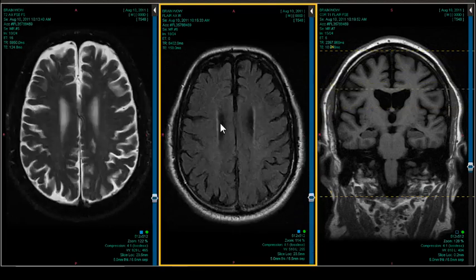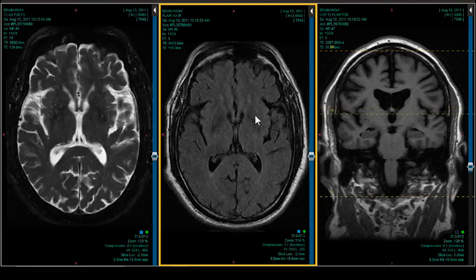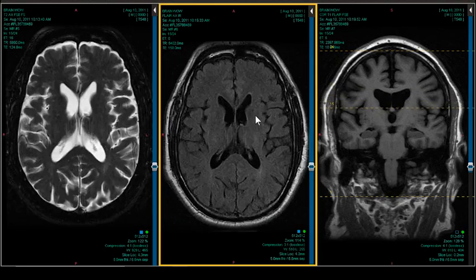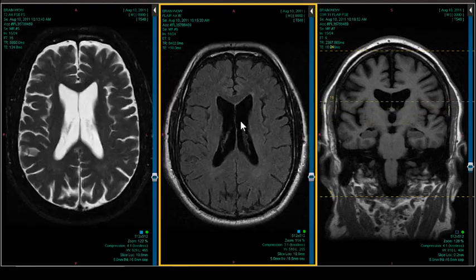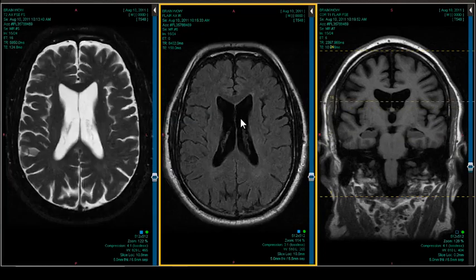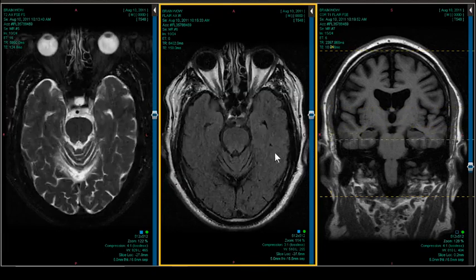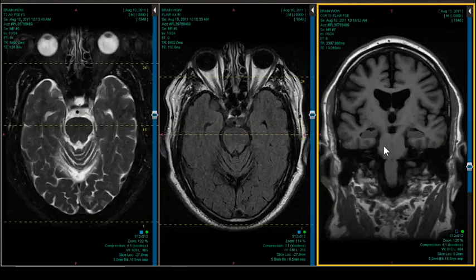I think genetics too matters. People want to know, if they've got something that's heredofamilial. And that's going to turn out to be really important in this case. So you could say, okay, is it frontoparietal or what is it? Well, actually, it is pretty sort of central. And when I first was looking at this case, I was like, well, there's some atrophy, but it's a strange pattern. Not a lot of frontal, parietal, temporal, right? Meaning if it's neurodegenerative, the first thing you look at is going to be the temporal horns, right?